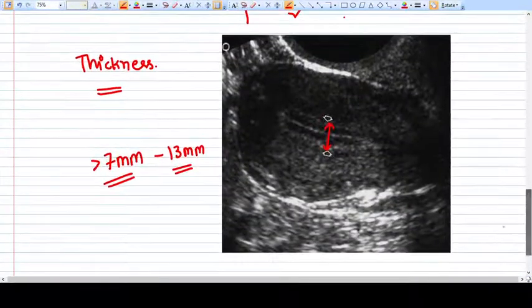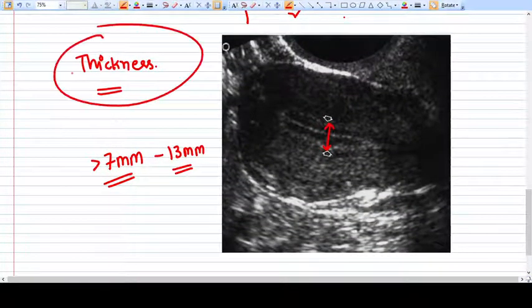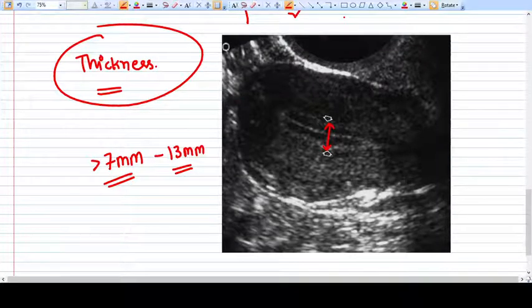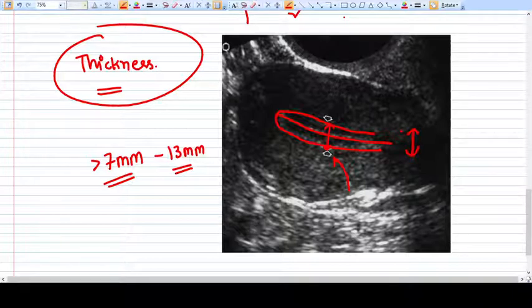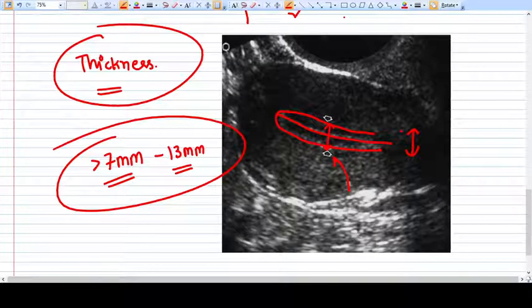Now let's talk about thickness — what it should be and how we measure it. Here is a triple line endometrium of the late follicular phase, and this is how we measure the endometrial thickness on the machine. The normal thickness should be more than 7 mm and up to less than 13 mm, and this kind of endometrium is considered normal.